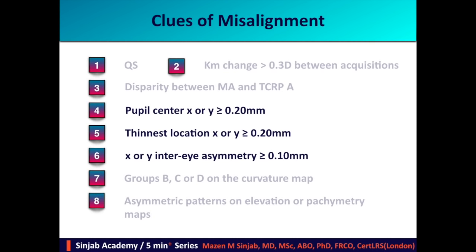We have to study each eye separately. If studying the right eye and I find x or y of the pupil center 0.2 or more, I have to think of misalignment. Another example: if in the left eye x or y of the thinnest location is 0.2 or more, I have to think of misalignment. Now I compare both eyes in terms of x and y for pupil center and thinnest location. For example, if the x coordinate of the pupil center in the right eye is 0.1 while in the left eye it is 0.3, the difference is more than 0.1 — in this case, there is misalignment.